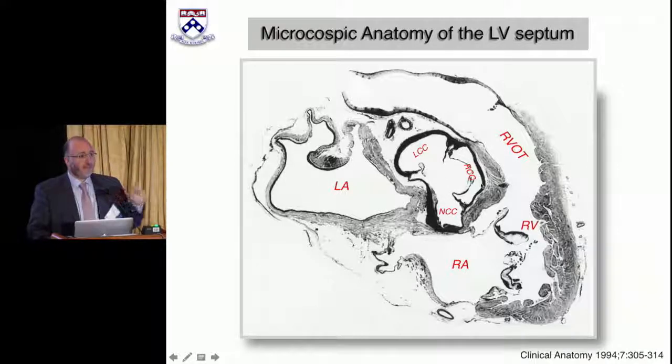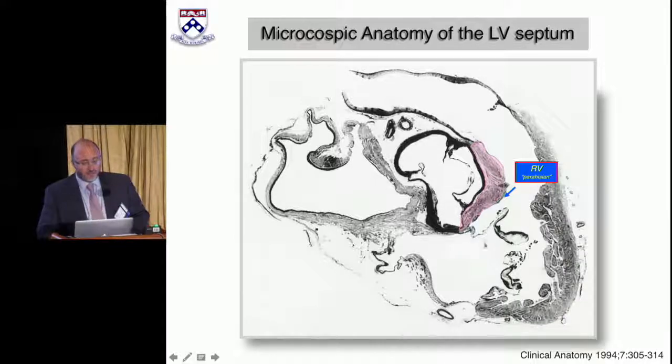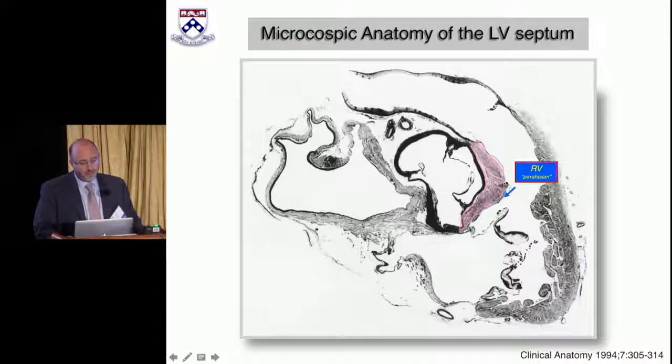The arrhythmias that we're talking about today, the focal origin is from this tissue. This tissue right here, which is the septum. It's the posterior septum of the left ventricle. And when we go to map this, and you put a catheter in from the right ventricle and clock it, you're on top of the His. You get that His potential. But what we need to think about is the catheter moving forward. Obviously, it's later because now you're in the RVOT.